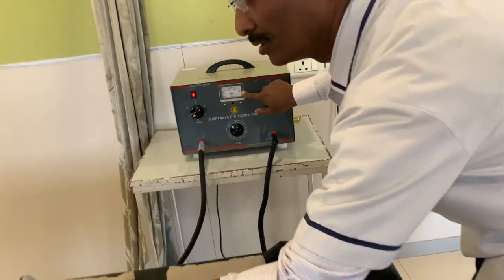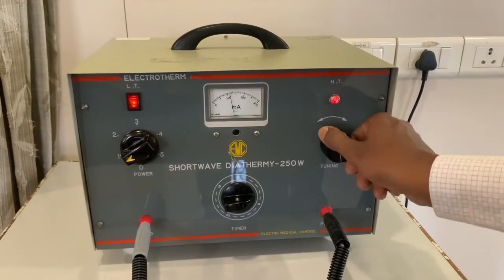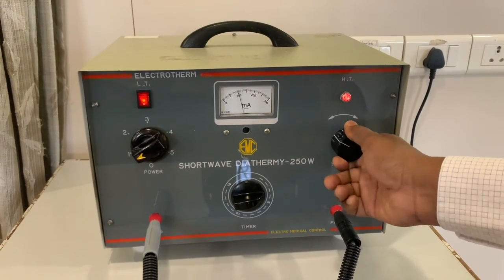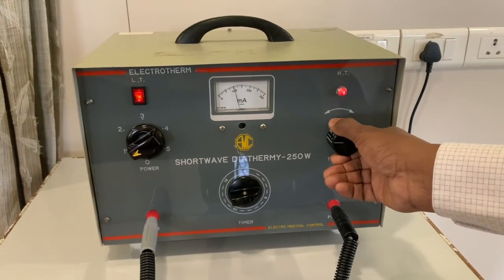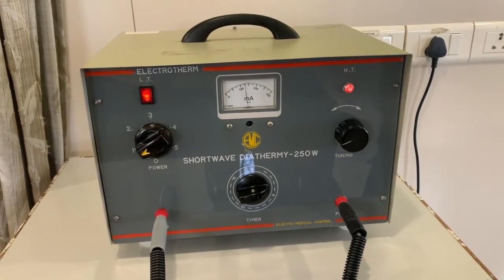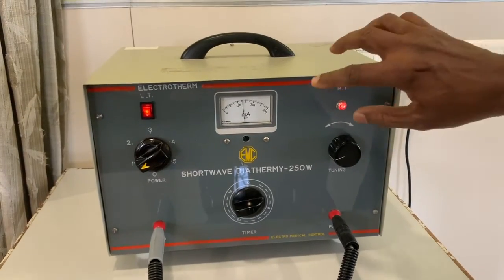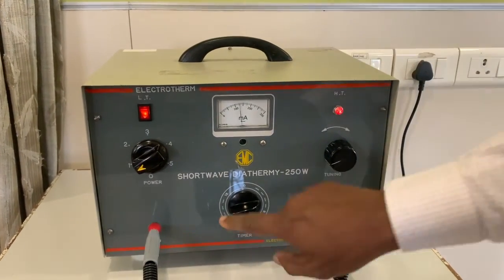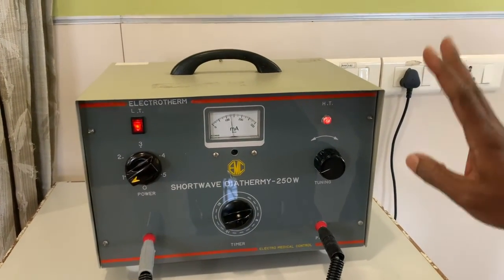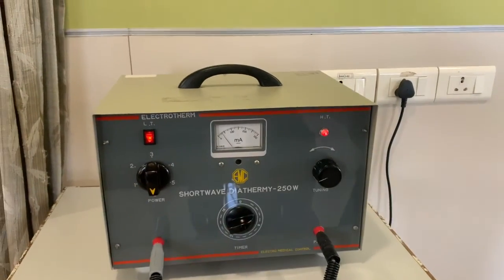Next, if you see the ammeter, it is showing you the reading. When I move the tuning knob, you can see different points where the intensity is increasing and decreasing. I'm going to stop it where it shows the maximum reading. This is the point where it is showing you the maximum reading. I can feel maximum warmth when the machine is tuned. Now the ammeter is showing you the maximum reading at this level, that is the level 1. So I say that the machine is tuned. This is the first method of testing. Then I can bring the power to 0.